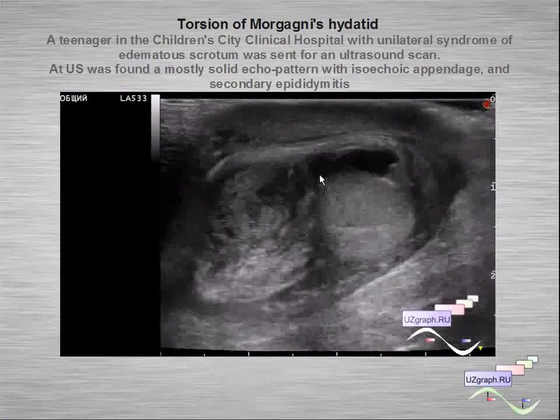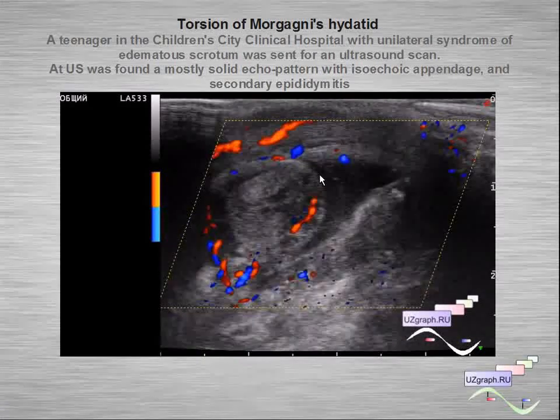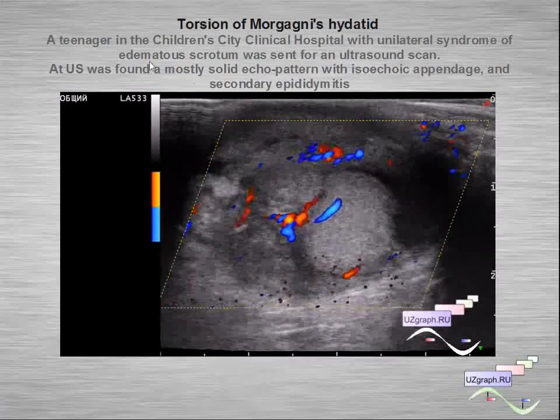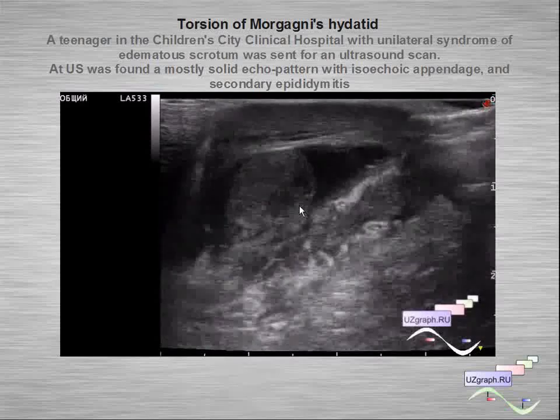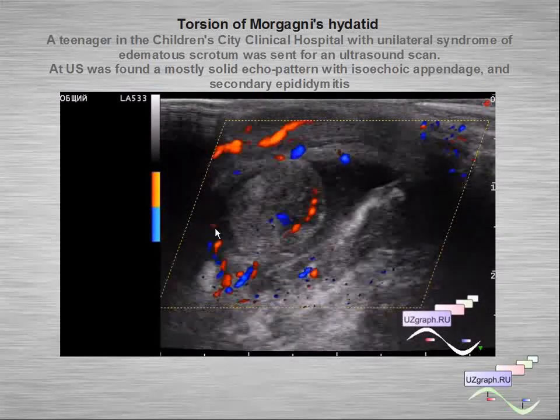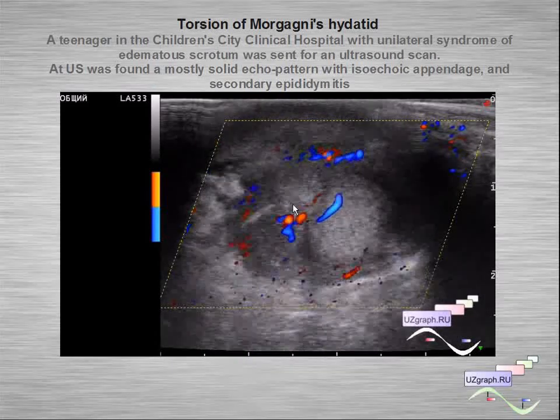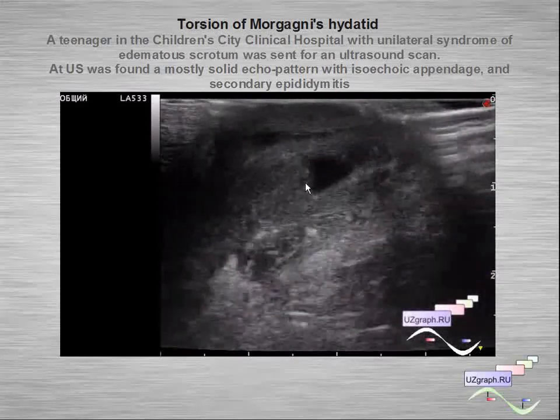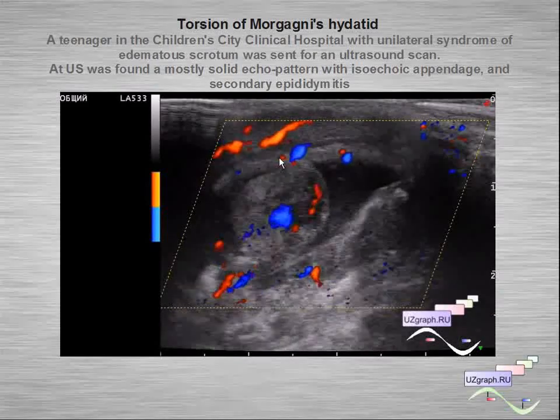Another example of torsion of Morgani hydatid — a teenager. On ultrasound we can see an enlarged epididymis and a solid echo pattern of the hydatid — Morgani hydatid or testicular appendage — with secondary epididymitis.